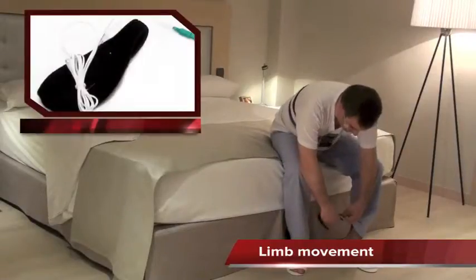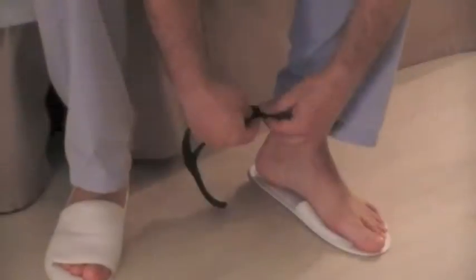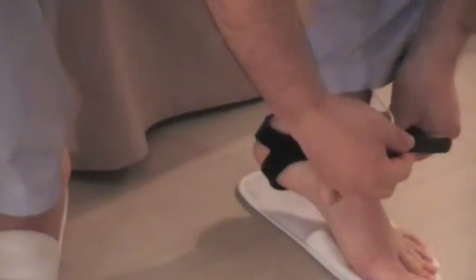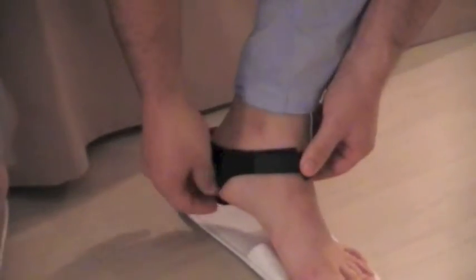We will place one sensor that detects the limb movements along the sleep period. Place the harness behind the heel and fix it with the velcro that sits on the sensor. Introduce the cable in the pyjamas and introduce the green connector of the sensor in the grey connector of the device named auxiliary.